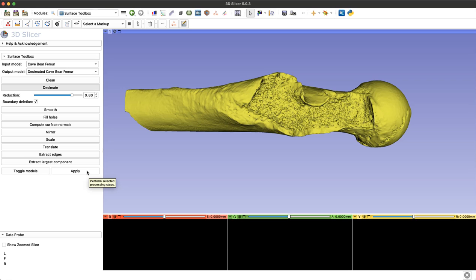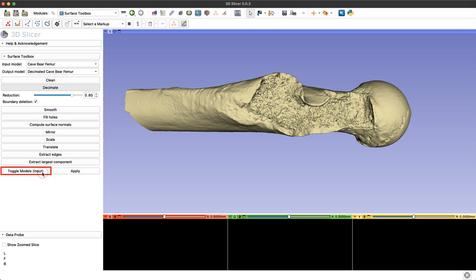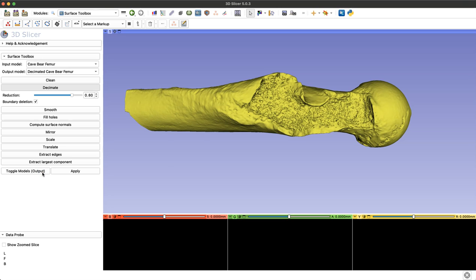This in yellow is the new reduced file, and I can toggle between the original model and the new model by selecting this toggle models option. You can see that the text input and output keeps changing as I switch between those two models.